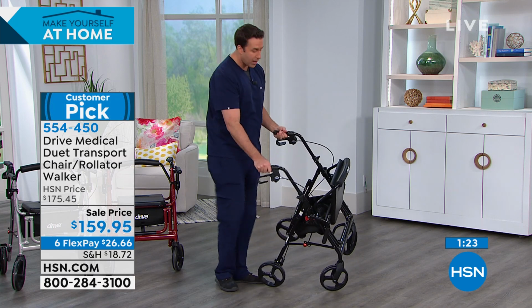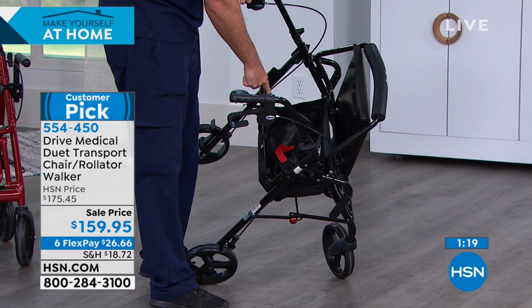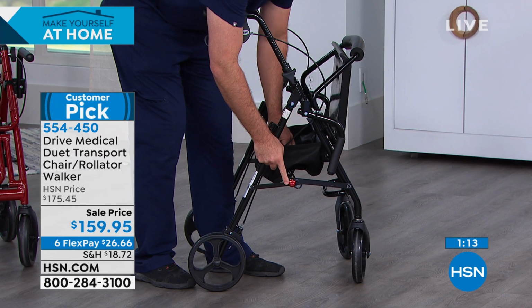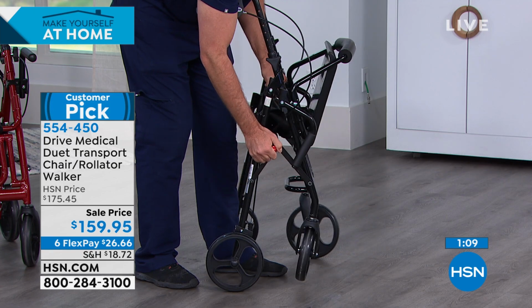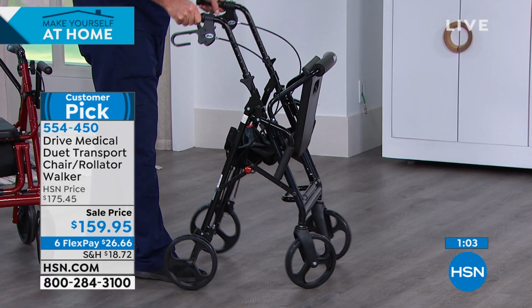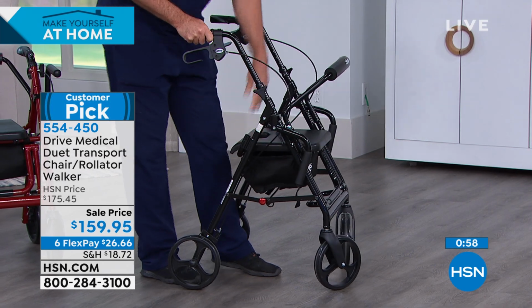I wanna show you how simple it is to fold because I'm gonna put that seat up and I'm gonna tip this toward you again. So you can see that there's a red handle underneath inside where you stow all your items safely, okay? So I'm gonna go ahead and look at this right here. There's a red safety pin. I'm just gonna pull up on that handle inside and pull that safety pin, and you see how it folds up just like that. So it's going to lock in the folded position. I can't open it, and then it's going to lock in the unfolded position.